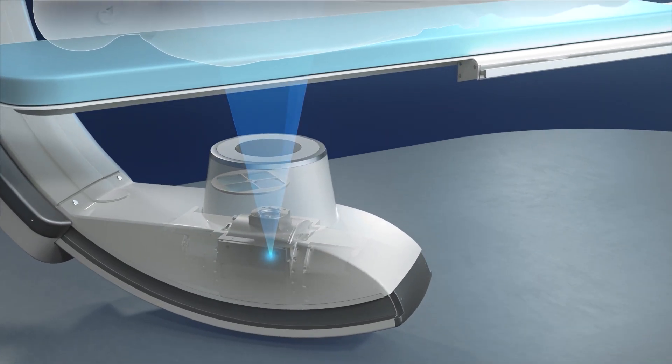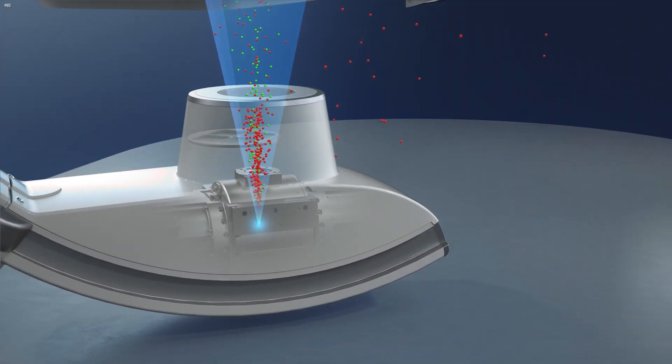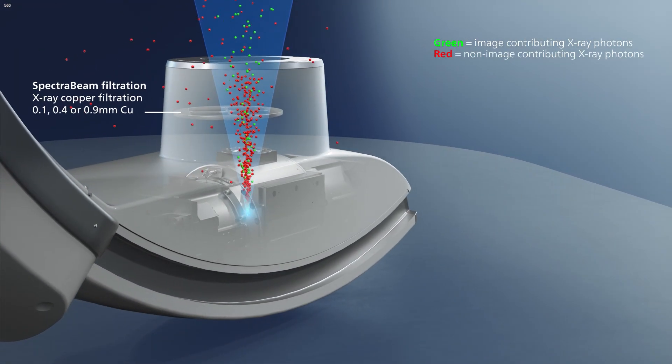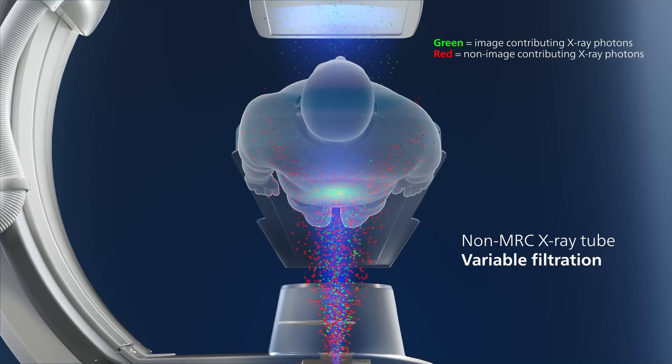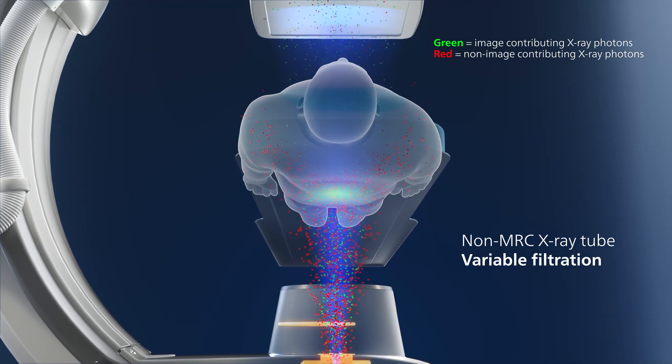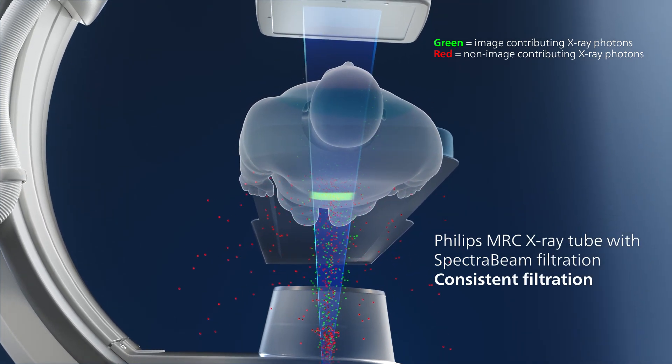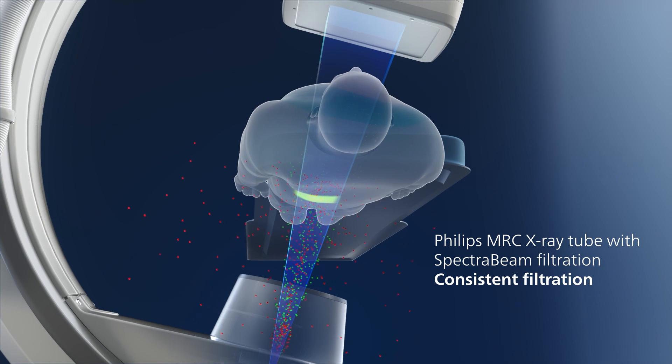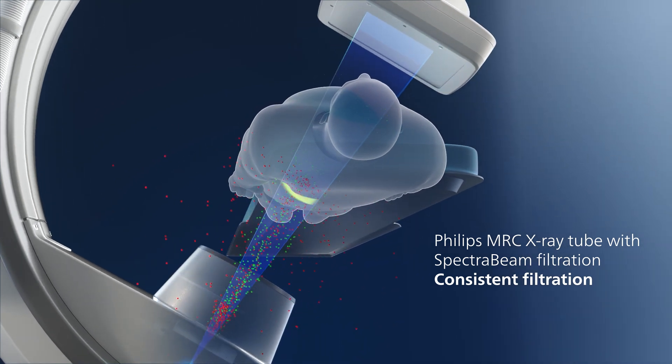Spectra beam filtration is enabled by Philips unique MRC x-ray tube with improved performance and reliability. The unprecedented heat dissipation delivered by the tube enables spectra beam filtration to manage the patient's x-ray dose while maintaining superb image quality.